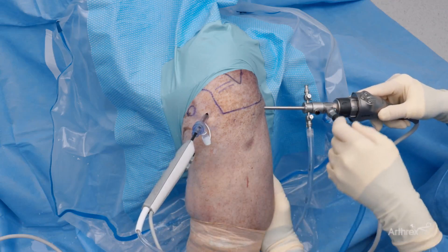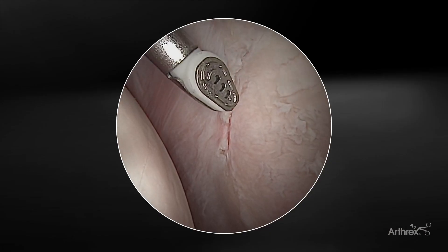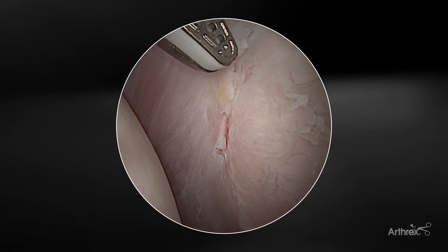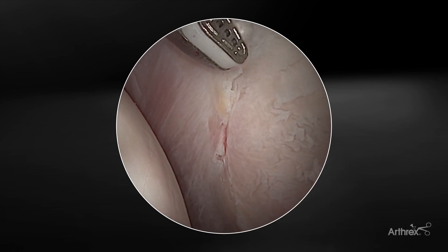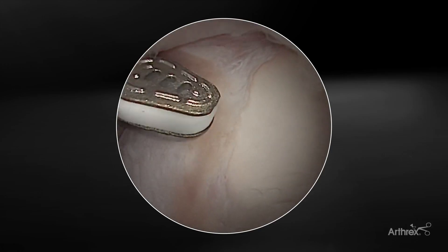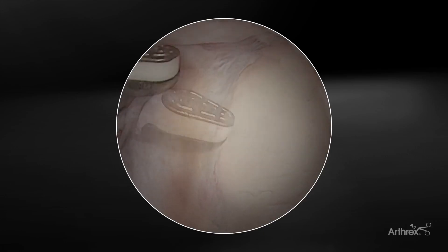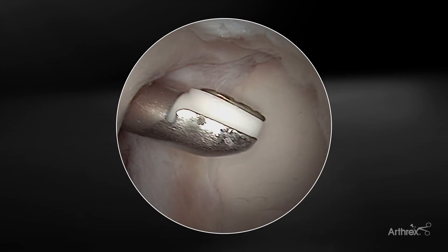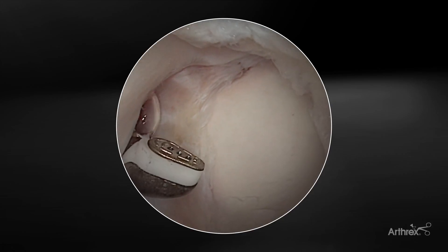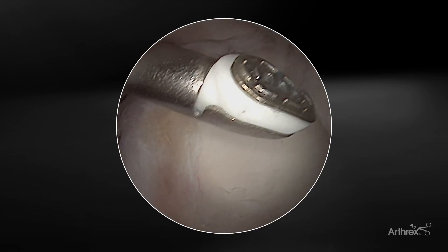I'm going to change my view. Looking more inferiorly, there's some degeneration down low as well. Activating the device, you can see that target tissue react, taper down and get smoothed out. Looking at the superior labrum, it appears the patient has a degenerative SLAP tear. If we're going to debride a little of that superior labrum, same technique — activate the device just off the tissue. You can see that plasma form, and as it contacts the target tissue, you see those macroscopic changes in the tissue.